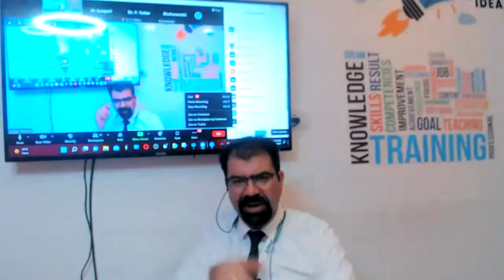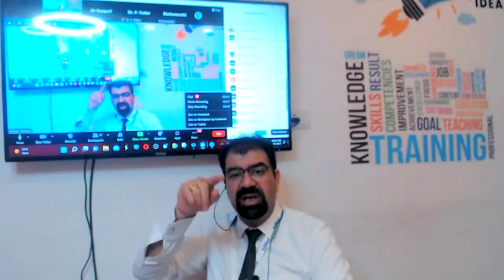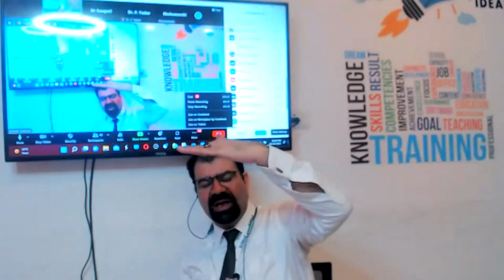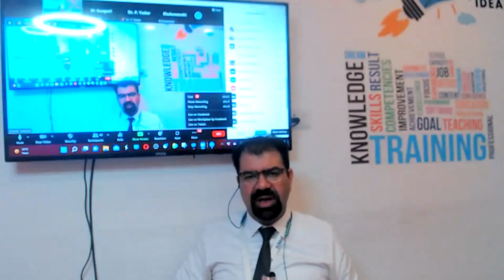Whosoever has completed the Doppler will understand what I mean by peak systolic velocity. It is not the RI, it is not the PI, it is not the S by D ratio, it is the peak of the systole. I have to see the scale and the peak of the wave, and if it is near to 10 centimeters per second, then that is about to rupture follicle.